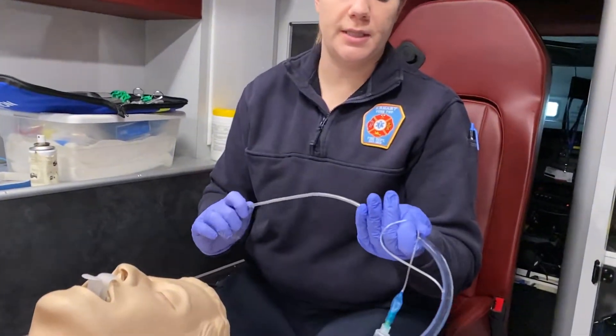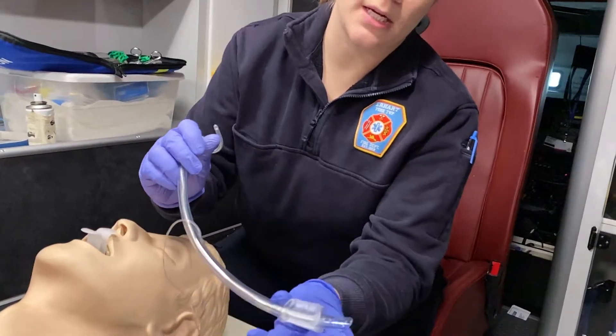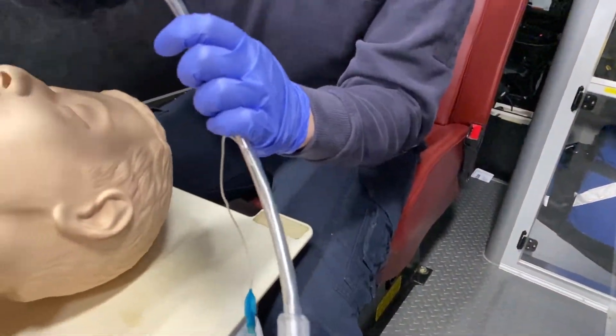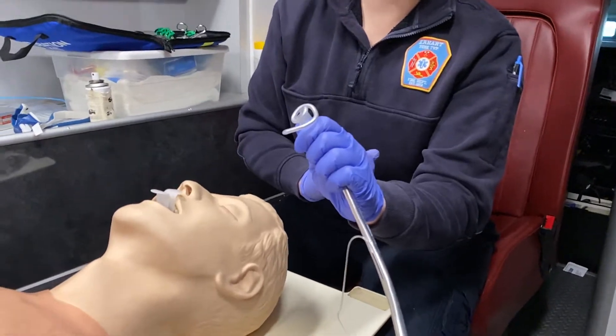You're going to insert your stylet into the ET tube. You want to make sure that your stylet does not go past the eye of Murphy, because it could come out the side and cause damage to the airway.